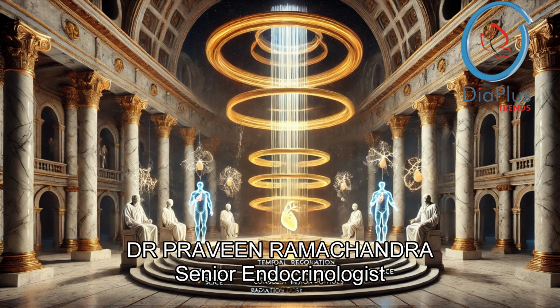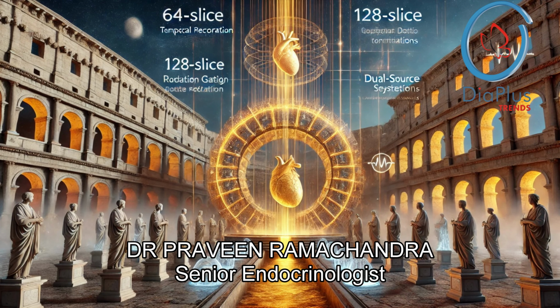One of the first things they emphasize is slice count. Think of it like the resolution of a digital camera, but for your heart. So more slices means a sharper image, especially for those tiny, intricate arteries. The document recommends at least 64 slices, but ideally 128 or more. Even more, the better. So why is that so important?